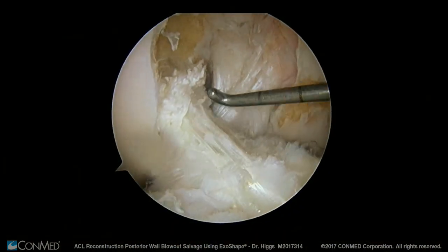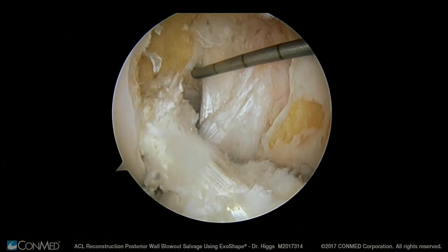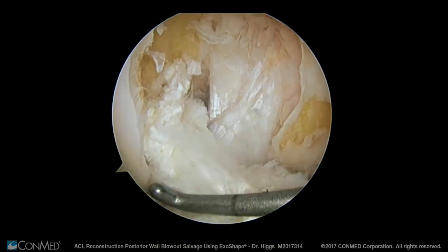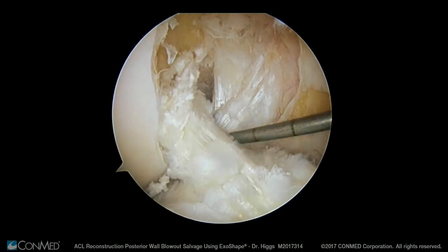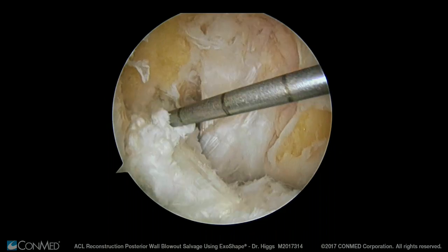So we've created a nice horizontal graft. You can see the triangle between the roof of the notch, the PCL and the ACL, and we've created a nice strong construct with interference fixation with a radial compression force, despite blowing out our posterior wall.